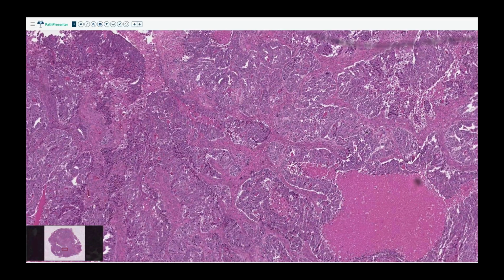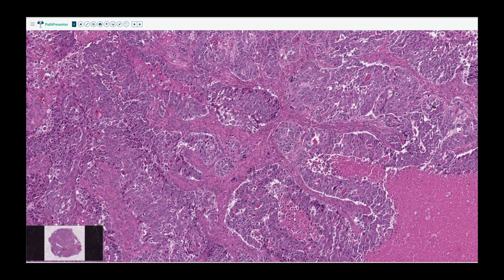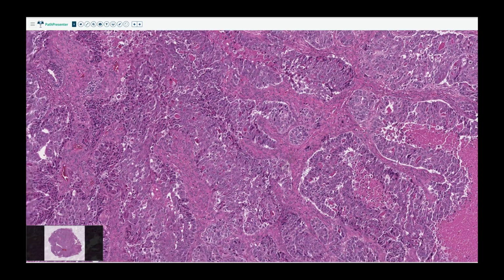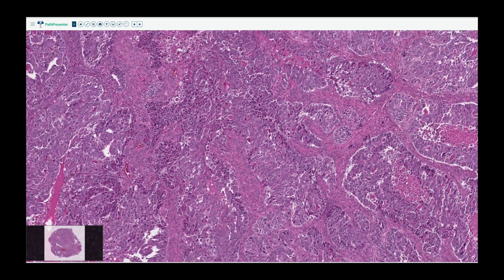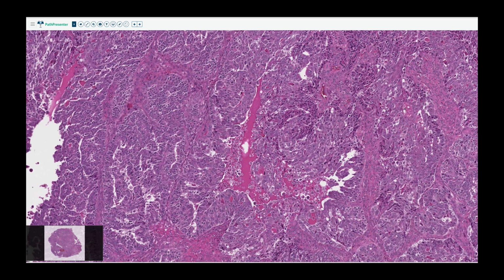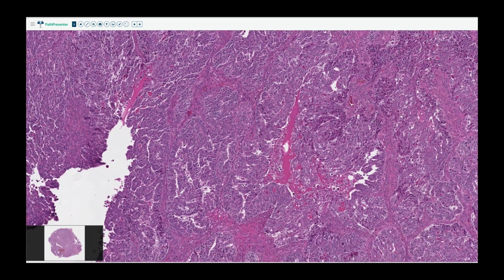It's high-grade ovarian serous carcinoma, and this looks like it's in the ovary, right? And so you actually have necrosis here, which you may or may not see. It doesn't need to be seen in high-grade ovarian serous carcinoma. Whenever you see necrosis, you always just want to think, am I looking at a high-grade tumor? You not necessarily are. This has a lot of other good features like apoptotic cells, so cells that are just dying. Those similar features to the case we just saw with the macronucleoli and the pleomorphism. And I'm trying to see mitotic activity. So this is a good contrast to those low-grade serous carcinoma cases where you won't necessarily see those morphologic features.